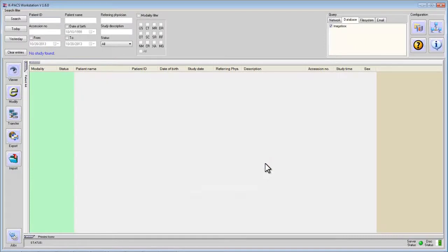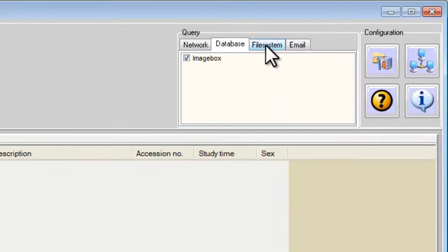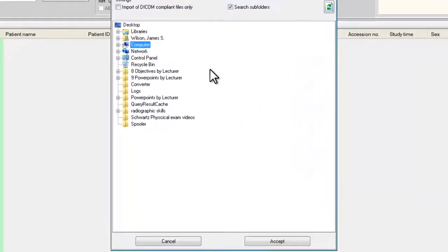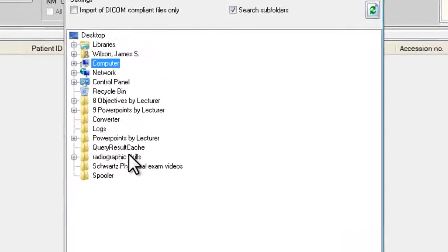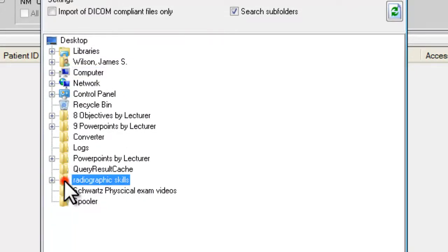To load the CT images, I first go up to File Systems. Click on File Systems and this menu will appear. What you see is all the various files and folders that I have on desktop. Since I put Radiographic Skills on desktop, I click on that folder.